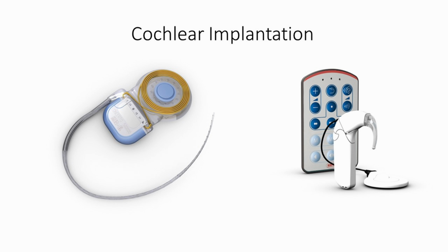And for those people that still have a functional cochlear nerve, we can use a cochlear implant to electrically stimulate the cochlea where we are unable to stimulate it auditorily. This is a typical example of a cochlear implant. There's lots of different devices on the market, but essentially this is the electronics package that goes underneath the skin behind the ear, and then this electrode is inserted into the cochlea, and you can probably just about make out lots of little electrodes along the end of it, and that allows electrical signals that are frequency specific to be sent into the cochlea, and they then are picked up by the cochlear nerve and the patient can then hear.